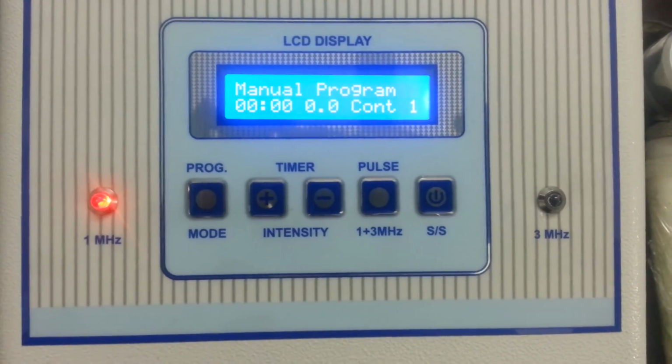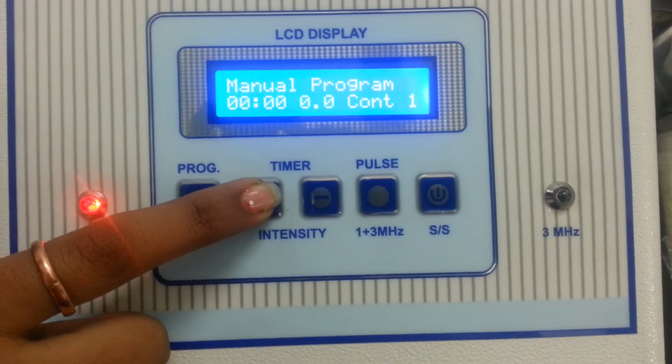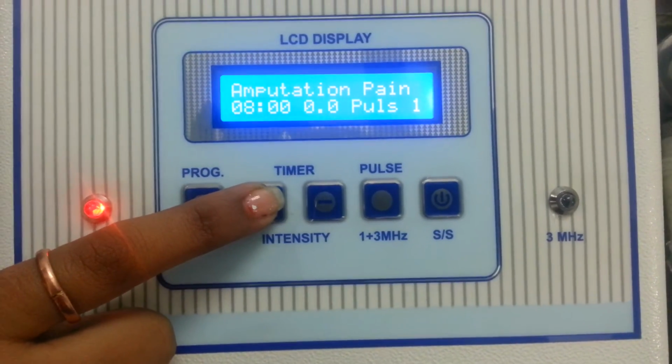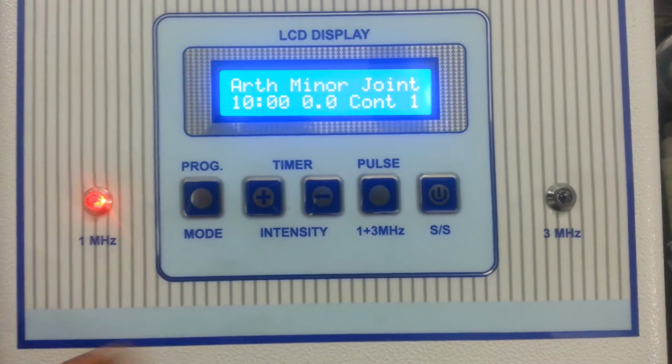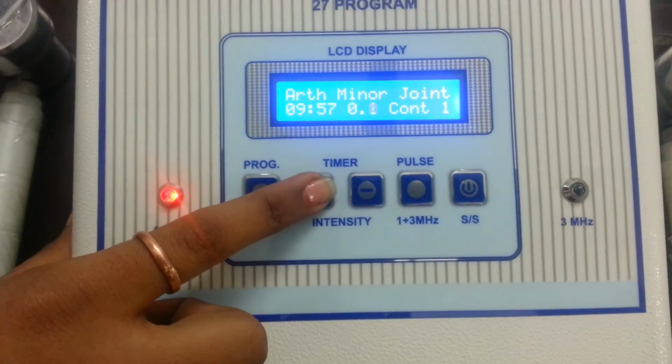Now we will show you how to use the programs. Set the program by pressing plus button. Program 1. Program 2. After selecting the program, start the machine. Increase the intensity as per your need.